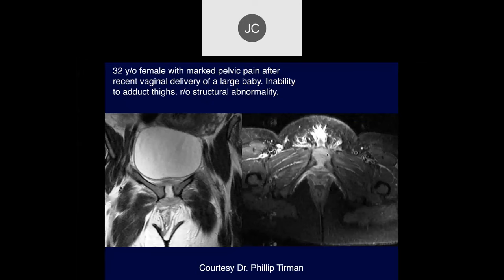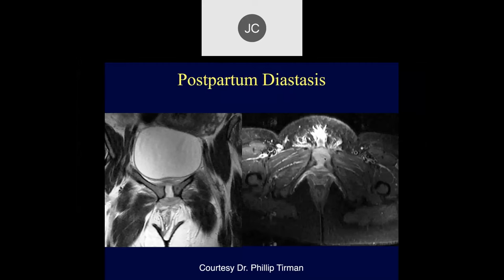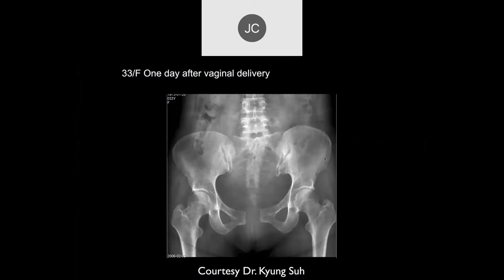32-year-old female with marked pelvic pain after recent vaginal delivery of a large baby, inability to adduct thighs, rule out structural abnormality. We see widening of the pubic symphysis and maybe capsular injury. This is called postpartum diastasis — basically a tear of the capsule with instability of the pelvic ring.